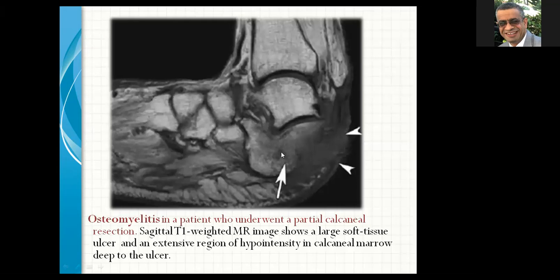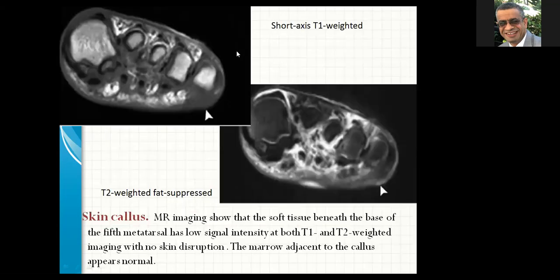Osteomyelitis in a patient who underwent partial calcaneal resection: a sagittal T1-weighted MRI image shows a large soft tissue ulcer and extensive region of hypointensity in the calcaneal marrow deep to the ulcer. Short-axis T1 and T2-weighted fat-saturated images show a skin callus. The soft tissue beneath the base of the fifth metatarsal has low signal intensity in both T1 and T2-weighted images with no skin disruption. The marrow adjacent to the callus appears to be normal.